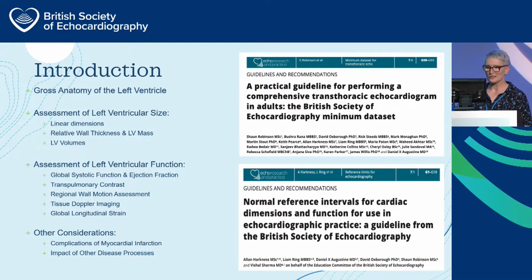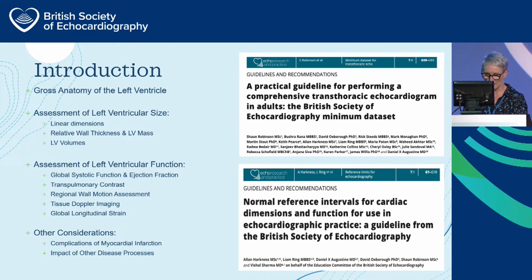So we've got quite a lot to cover in this session. It is a bit of a whistle-stop tour, so I intend to cover a bit of gross anatomy of the left ventricle, assessment of size, assessment of function, with emphasis completely on systolic function. I'm not going to mention diastolic function, that's a talk in itself. And then I'll just finish with a couple of slides just to highlight some other considerations when we're thinking about assessment of the left ventricle.